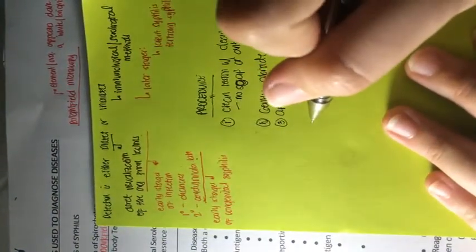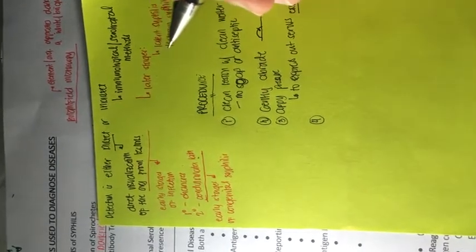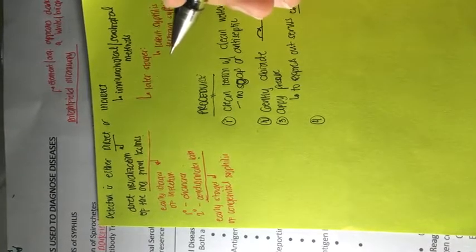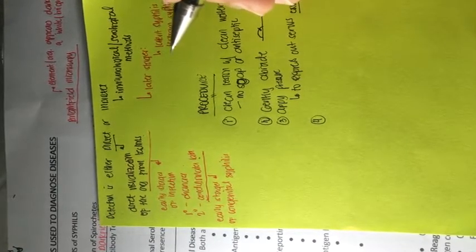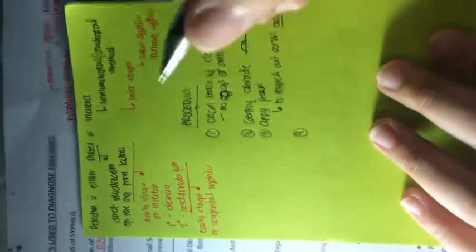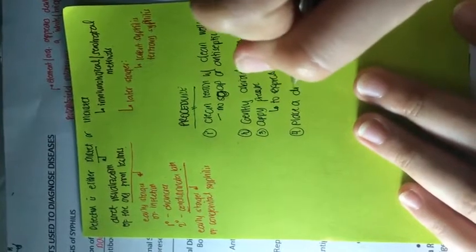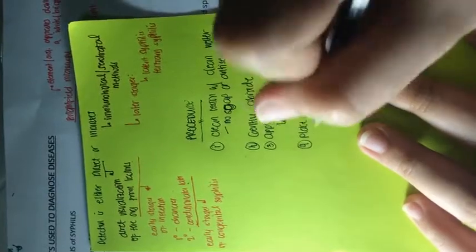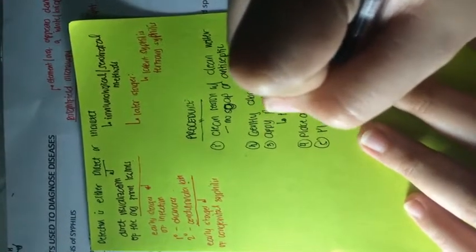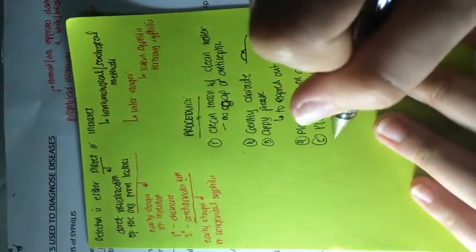So, in your AUBF, when you say transudate, it's usually clear. As for an exudate, it's usually cloudy. And also in exudate, there's presence of more WBCs and bacteria compared to transudate. And then next would be to place a drop of the exudate on a slide, then place a cover slip and then examine.